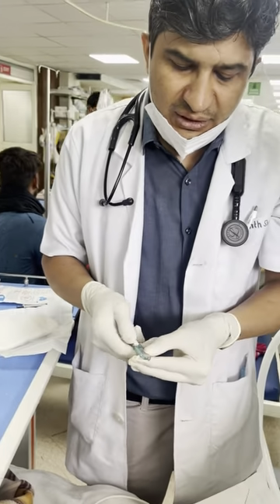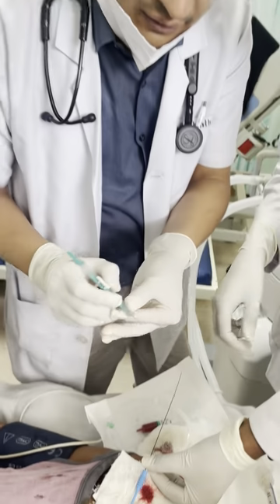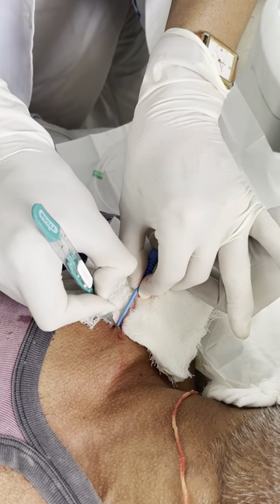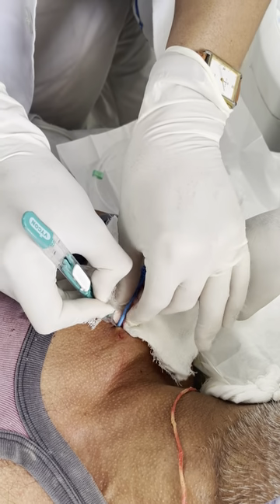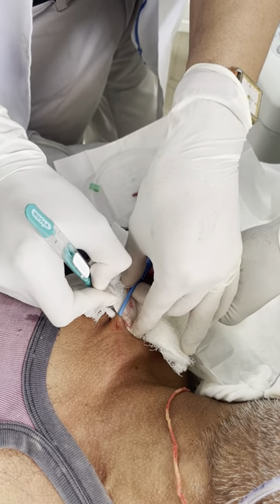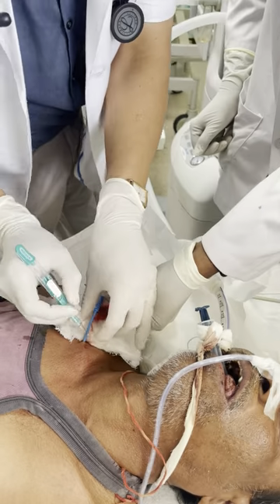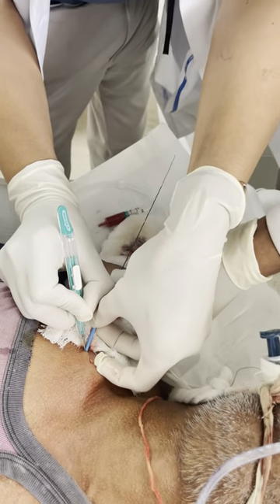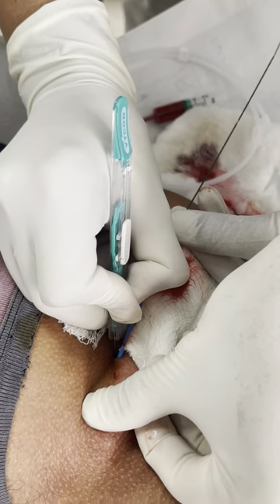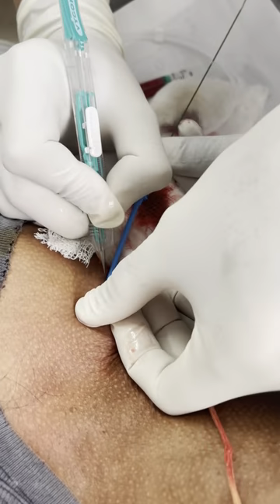We will give a very small nick. Where? Here. It might bleed, but it will. This is a better way. In fact, see like this. Hold the skin and give a nick. Did I hold it right? That's done.